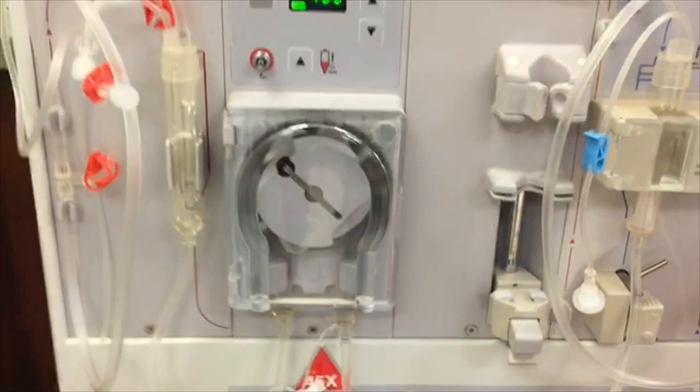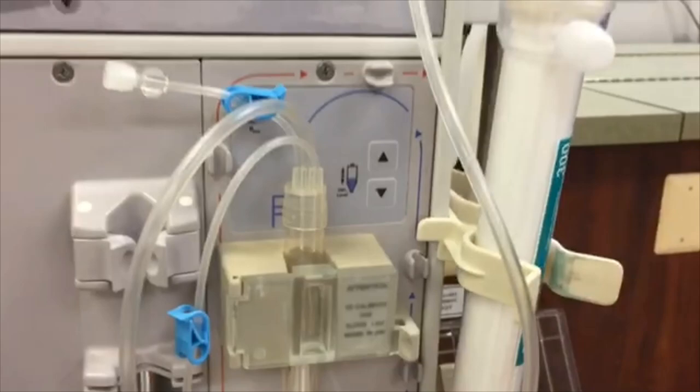All right, we have our arterial line, which is set up. You can see the saline dripping in. And then our venous line. And then this right here is where all the fluid is going to flow through the dialyzer. So this is priming.